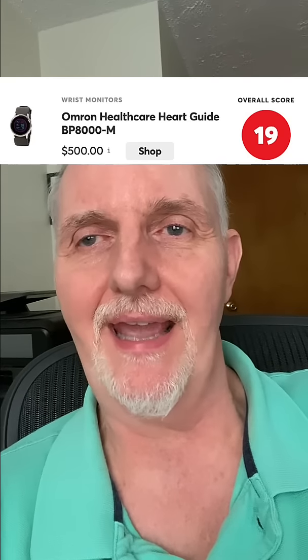Now, all that said, everything's not rosy with Omron. There was one brand that scored almost at the very bottom of the list, and that is the Omron Healthcare Heart Guide BP 8000-M, which scored only 19 out of 100 points. Now, this Omron brand is actually an activity tracker as well as a blood pressure cuff. It costs more than some Apple Watches, and it takes blood pressure at the wrist, which is generally less accurate than when you take your blood pressure at your upper arm.